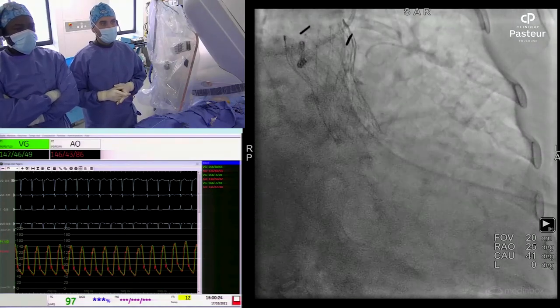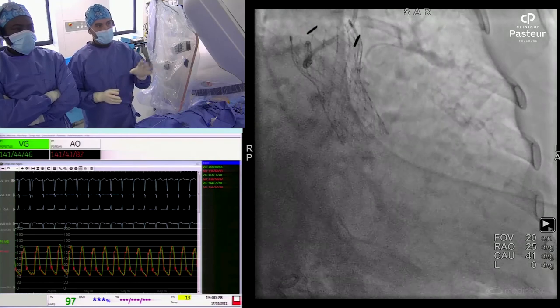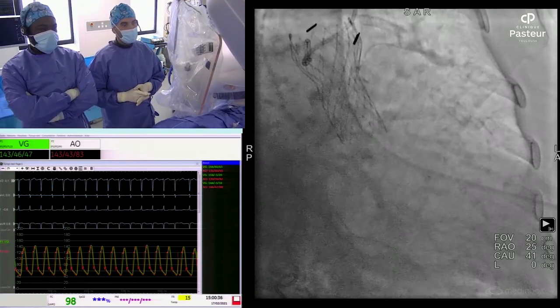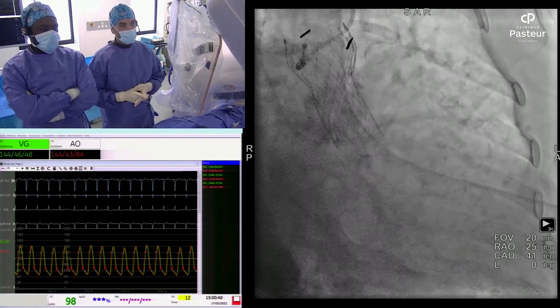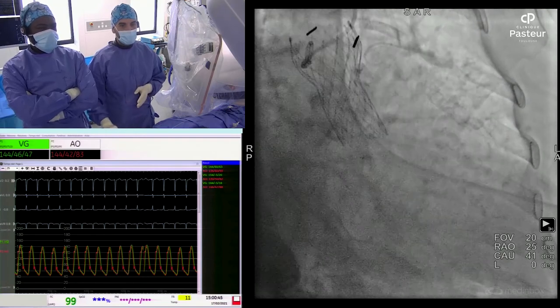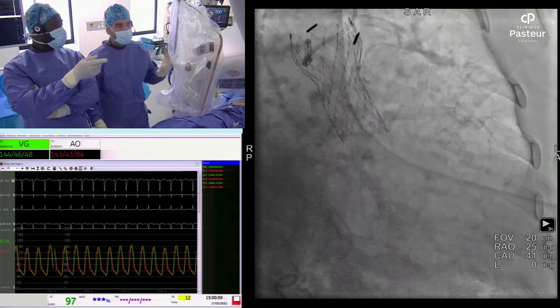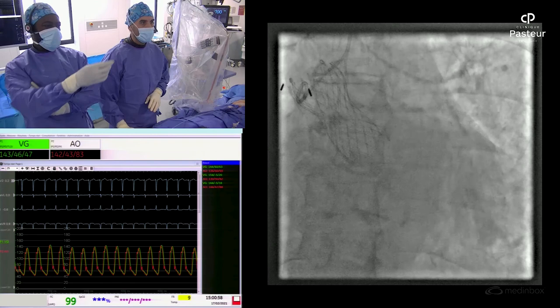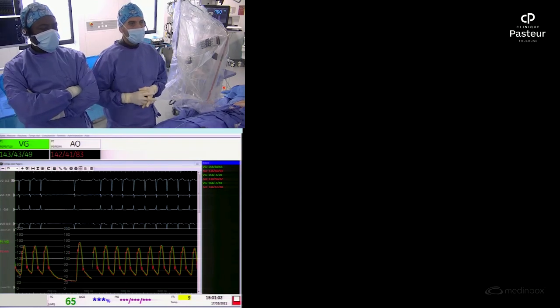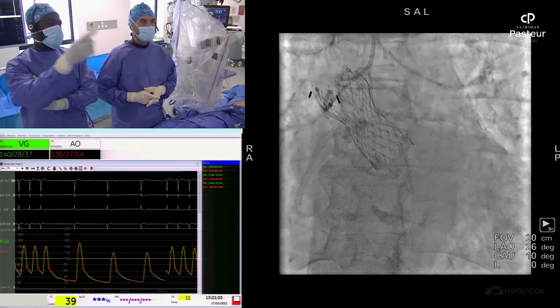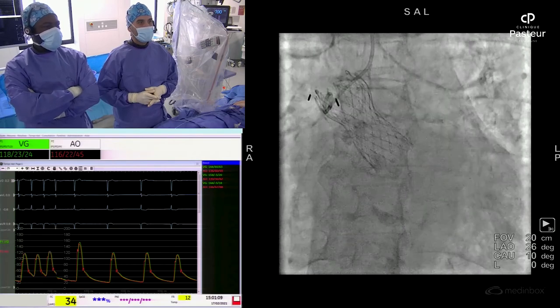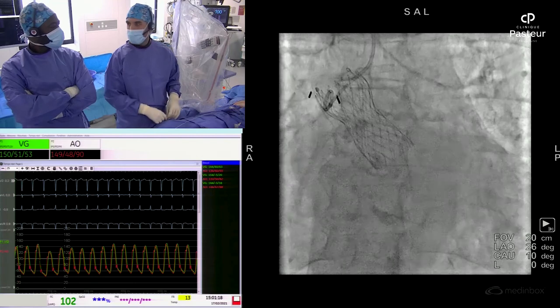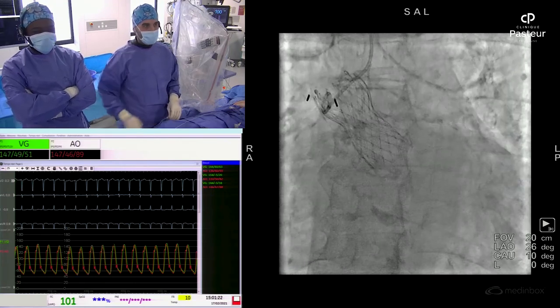Here is the final angiogram in the cusp overlap view. Several observations: first, our depth is perfect — 2 mm, which is good, in the non-coronary sinus. There is maybe trivial paravalvular leak but nothing significant. Commissural alignment is also appropriate — the c-tab is facing the coronary side of the anatomy in the RAO caudal view. In the LAO projection without injection, we clearly see the c-tab in the inner aspect of the right curvature — alignment is good. Femoral artery closure was successful with no issues.